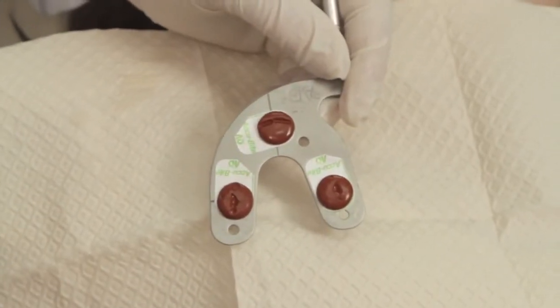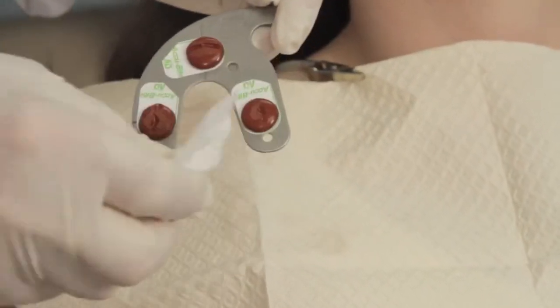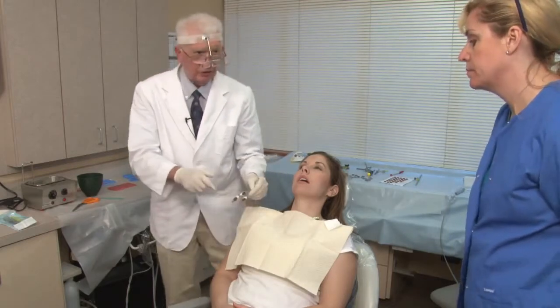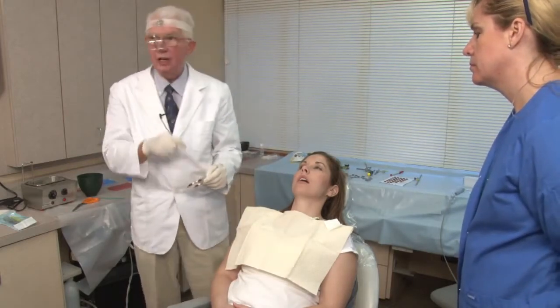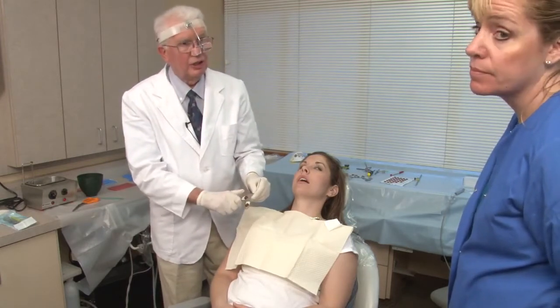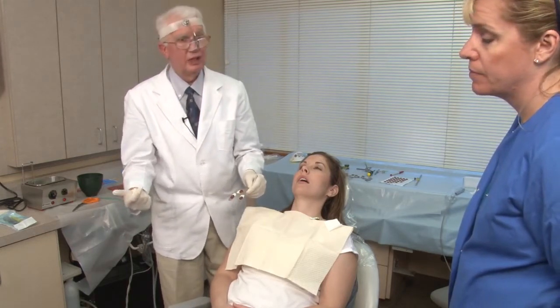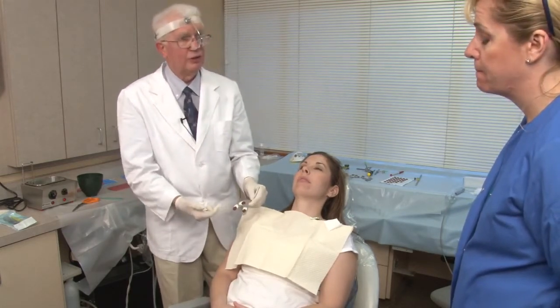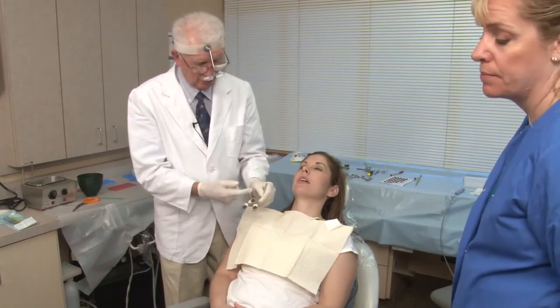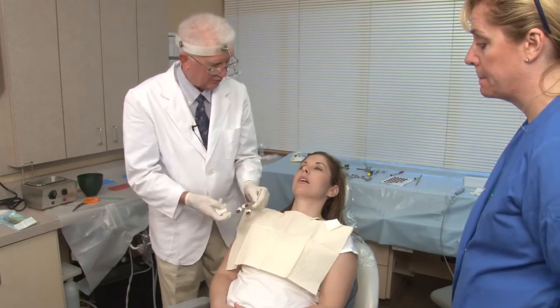Now, it's important that you trim the compound now, because in some instances, if the AccuBite doesn't stick good, and you've dismissed the patient, and you're in the lab working, and you realize, oh, I got to trim the compound, you may be trimming the compound, and the AccuBite comes off. Now, you got to call the patient back and do the whole procedure again. So make sure that you do all the steps one at a time and in the proper order to save your time and the patient's time.